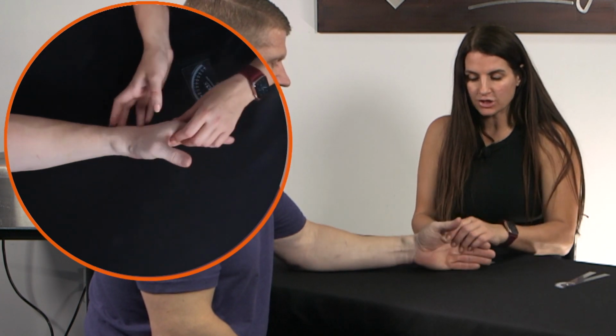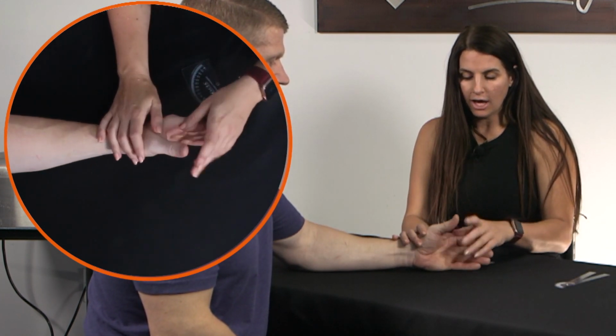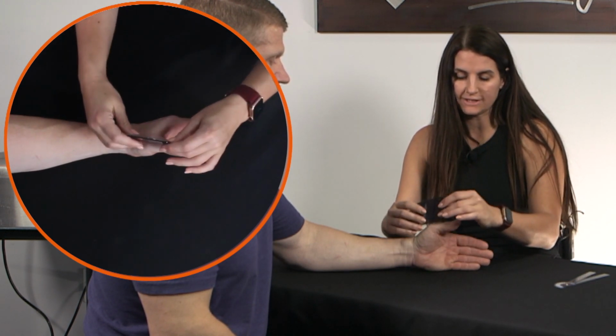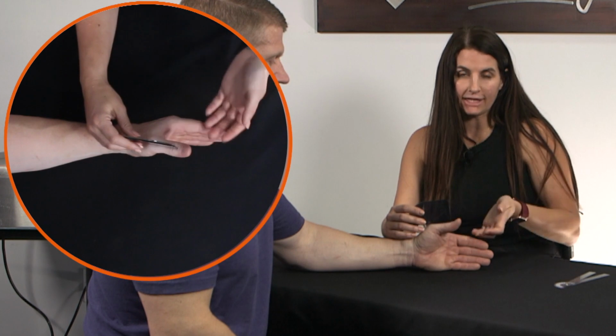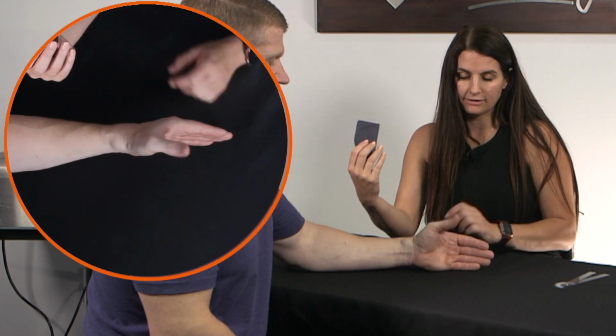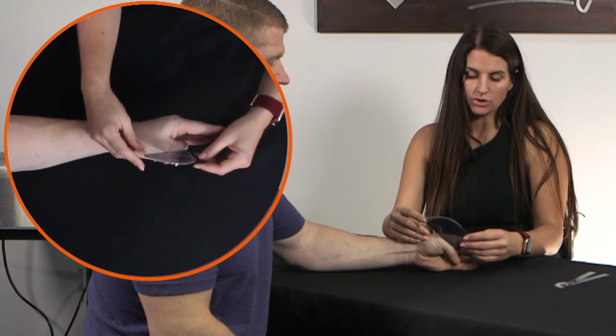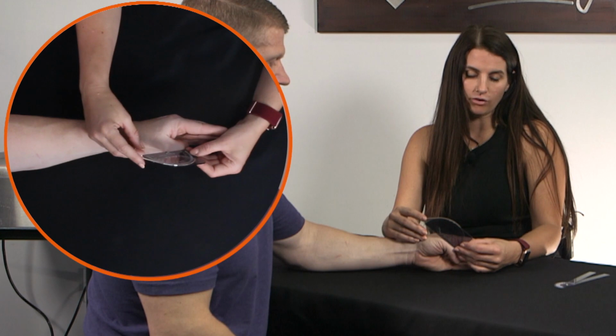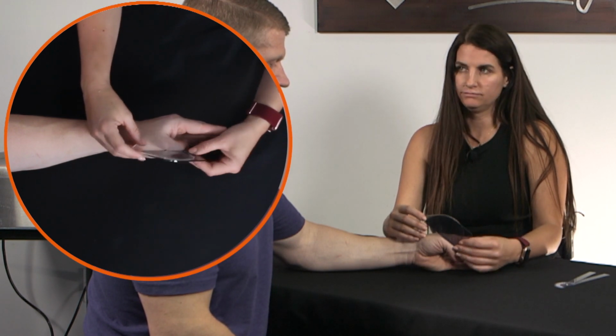Now for thumb flexion and extension, I like to measure extension first. So if he couldn't extend all the way, I would document that he had a 35-degree extensor lag. Now go ahead and flex. And then you would measure how much he is bending it. So it would be 45 over 55.